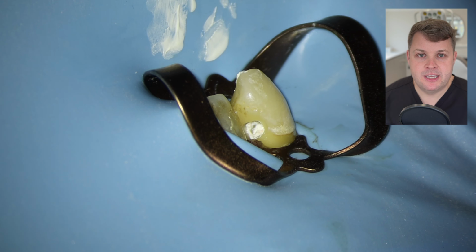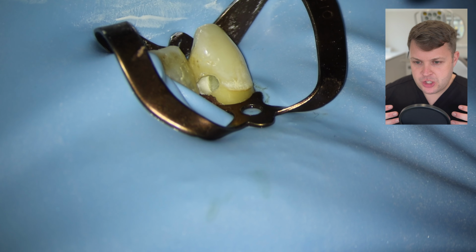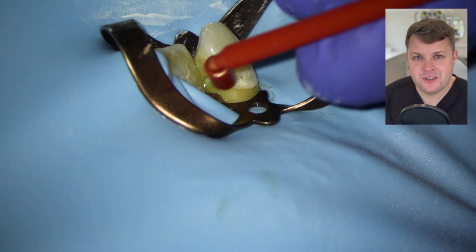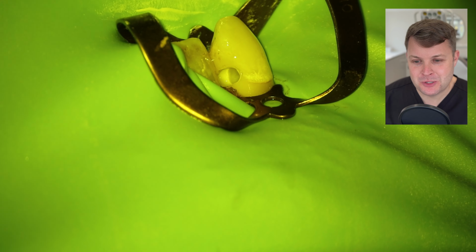First things first, I'm going to just remove some of the bioceramic with an ultrasonic tip. I'm going to put it in the conventional part of the access and also the buccal. And then I notice here that once we've removed the bioceramic, the GP isn't really condensed well into the orifice. So I'll just use my little heated plugger just to push that down.